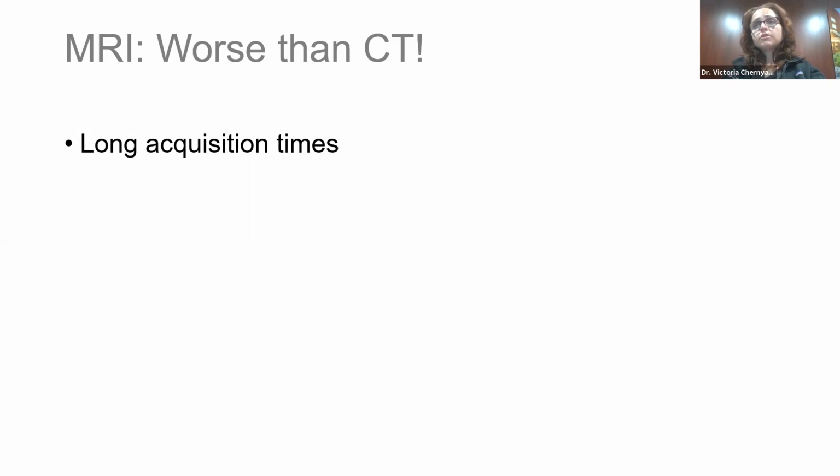Now, it may seem trivial, but if you go back tonight and just lie down on the floor and try to lie still for 10 minutes, you'll see how difficult it is. And when I'm talking about lying still, once the patient is placed in the MR scanner, they cannot move, because motion will degrade the images. So it's not an easy thing to do, and long acquisition times definitely are a drawback of MRI.